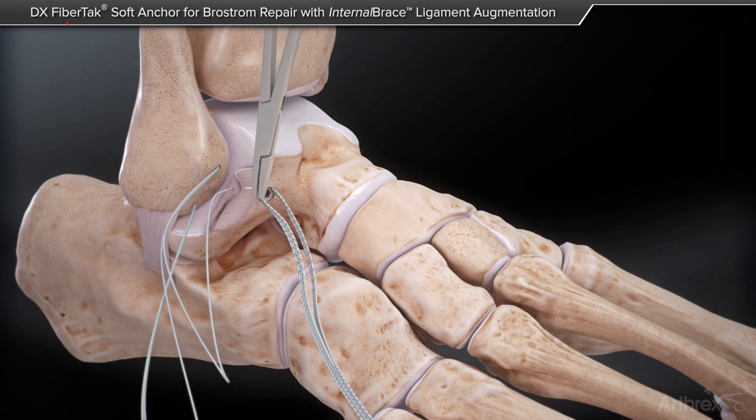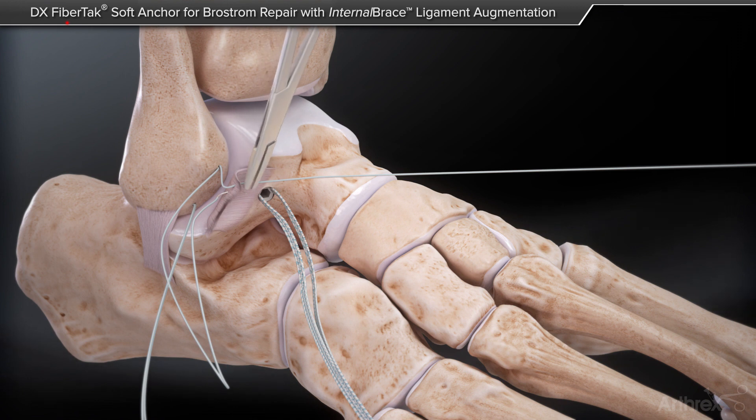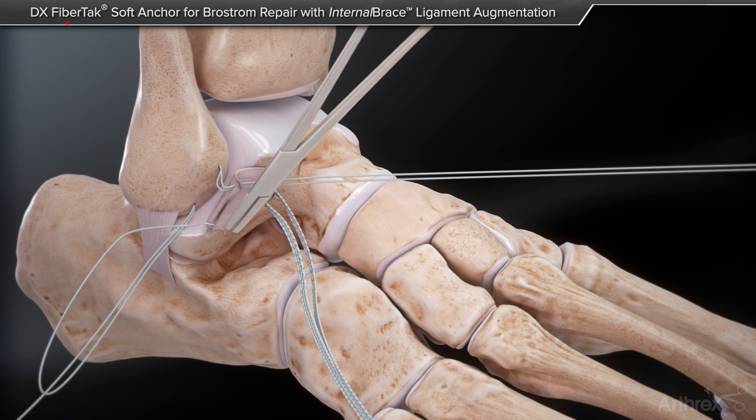Next, utilizing the number one fiber wire sutures and needles from the fiber tack anchors, proceed to pass the sutures through the soft tissue and tie them down to the fibula to complete the Brostrom procedure.